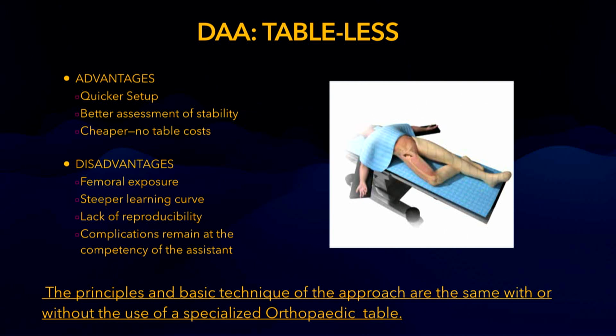Does the DAA need any specialist equipment? Yes. Does it need an extension table? Not necessarily. But in my experience, the learning curve becomes much easier and the femoral exposure becomes much easier when you use an extension table. I don't endorse it, but I know that in my private practice, I've suffered greatly while doing a direct anterior on a plain table.